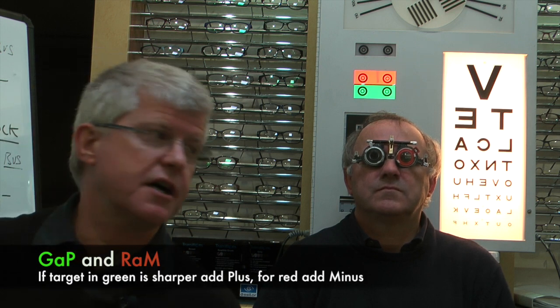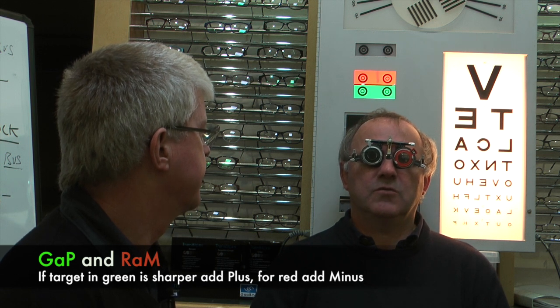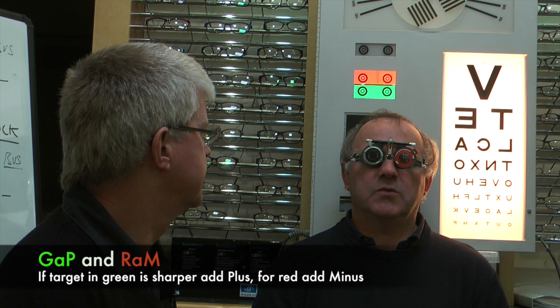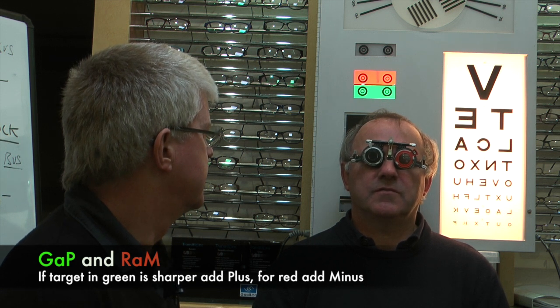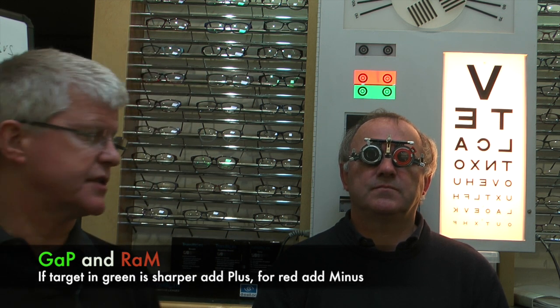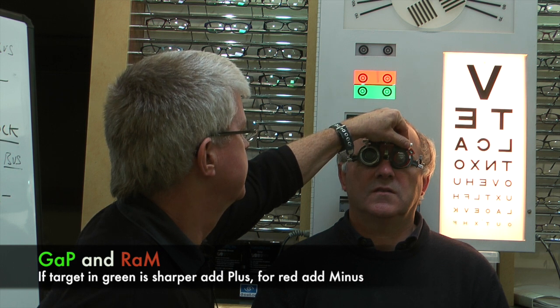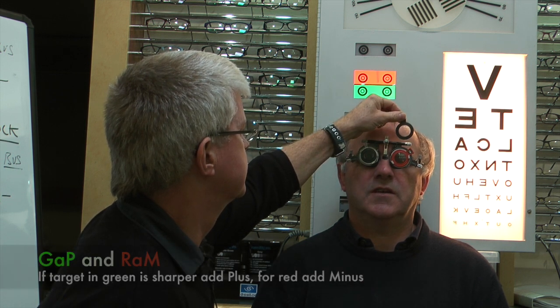We're going to look at the duochrome again, because it's always good to fine-tune the best vision sphere using the duochrome. Do the targets look clearer in one or the other? I would say they are just about equal — if anything the green is very slightly bolder and clearer, but it's almost the same. Well, we can add maybe a little bit of plus just to double check. So I'm going to offer up a plus 0.25 — looking at those two targets, does that equalize them? Yes, I think it does actually — the plus just equalizes. That's equal now.